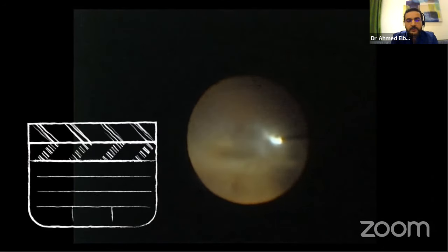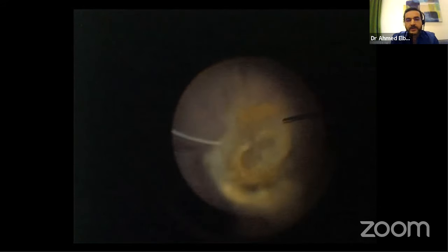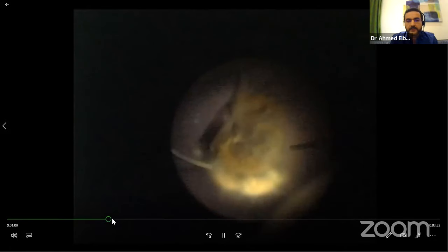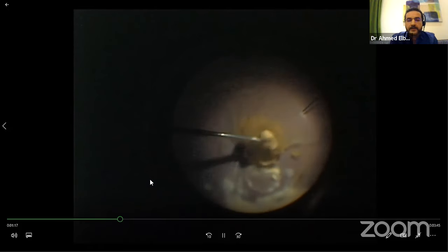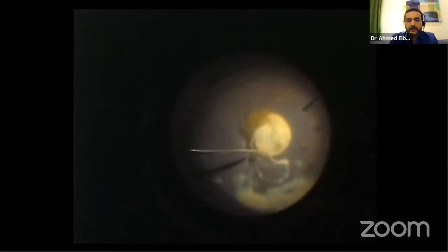Starting the vitrectomy was simple in terms of the vitreous hemorrhage. You can see the hemorrhage; you just remove it, and we find a lot of exudation there. At this stage, everything was fine. Just to go a little bit forward, this is the most important part. After removal, trying to remove the subhyaloid hemorrhage and the posterior hyaloid, you can see there is a ring of exudation exactly at the macula.